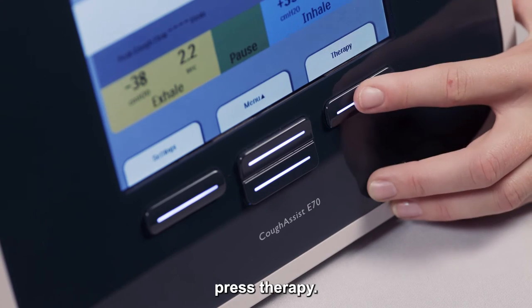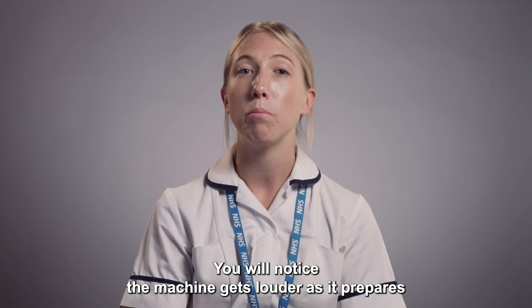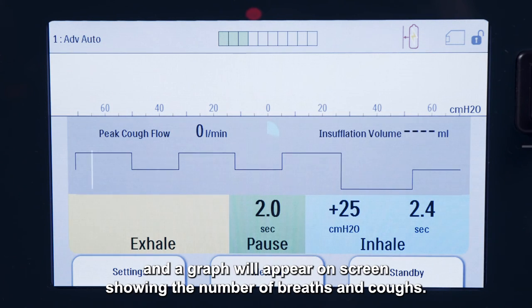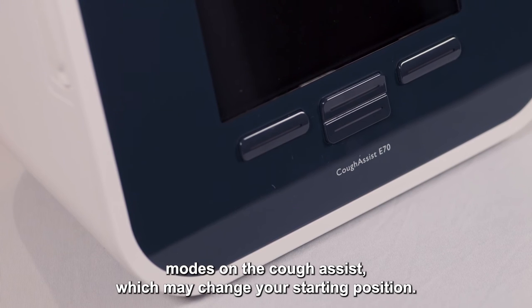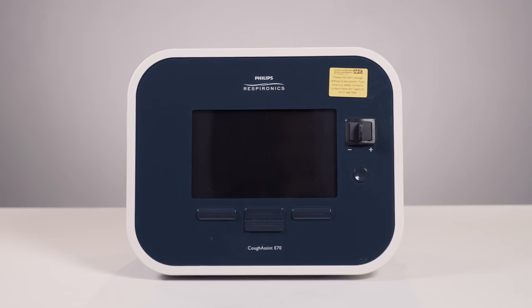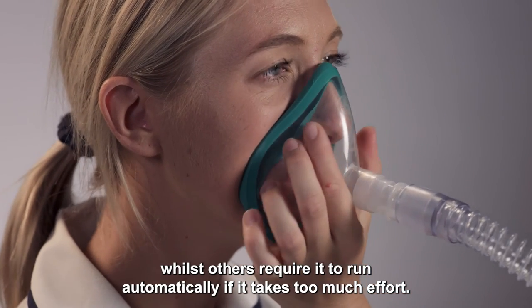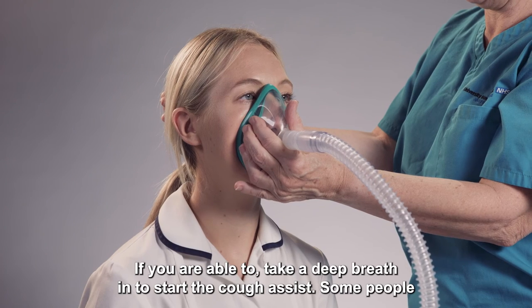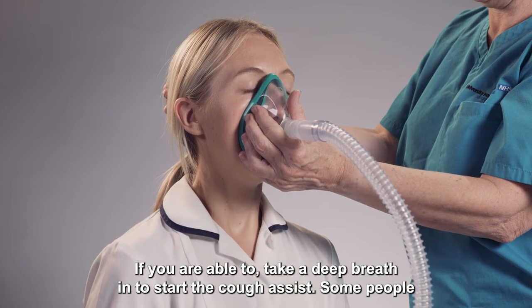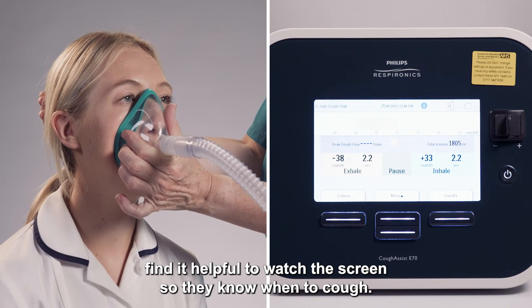To start treatment, press therapy. You will notice the machine gets louder as it prepares, and a graph will appear on screen showing the number of breaths and coughs. There are different modes on the cough assist which may change your starting position. Some people are able to trigger the machine to start the cycle, whilst others require it to run automatically if it takes too much effort. If you are able to, take a deep breath in to start the cough assist. Some people find it helpful to watch the screen so they know when to cough.